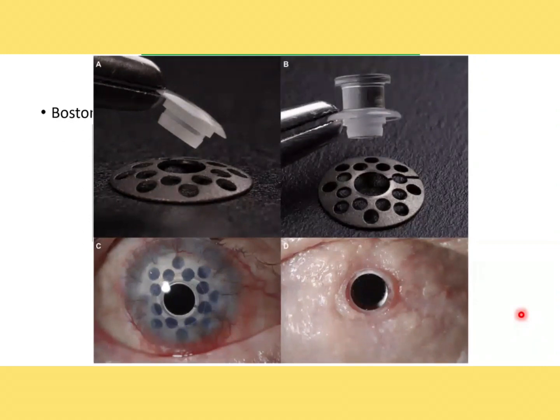If I talk about the advantages of this Type 1 K-Pro, see, this Type 1 K-Pro offers high optical quality, durability, and long-term stability. So it can provide significant visual improvement in patients with complex corneal conditions as well. Patients receiving Type 1 K-Pro require lifelong follow-up care to monitor potential complications like infection, glaucoma, or other abnormalities. So regular monitoring of intraocular pressure is very much important in this type of case.